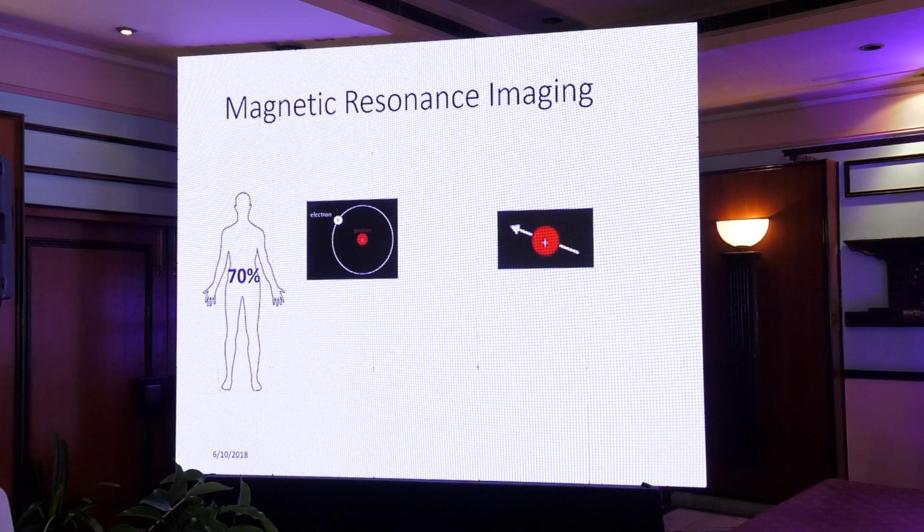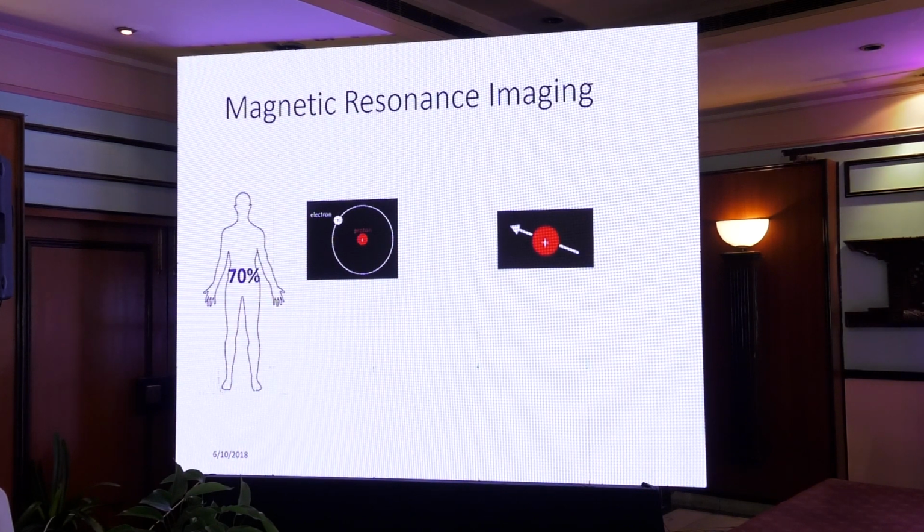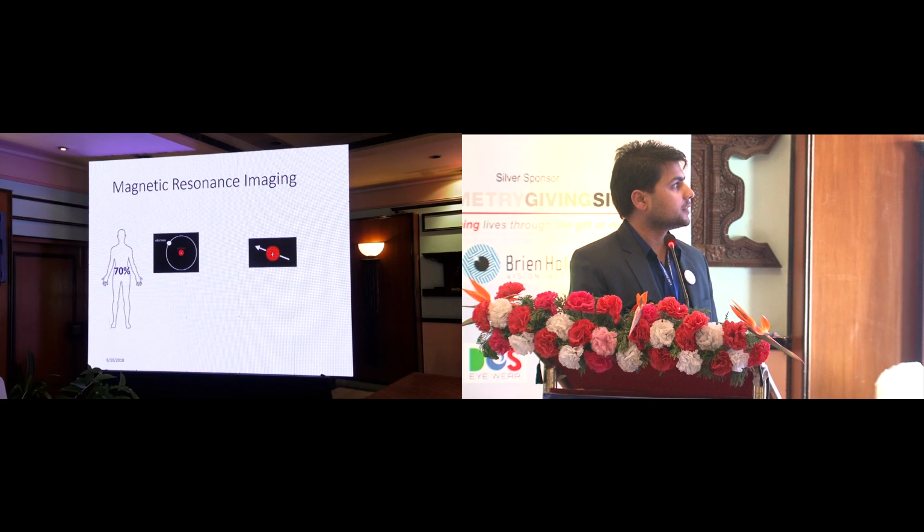But before going into that, I'd like to introduce this a little bit because it may be new to a lot of you. It works on the principle that there is magnetization in the human body. Because the human body is made of water, which contains hydrogen atoms, which contain the proton, a charged particle, there is a magnetization associated with that proton.